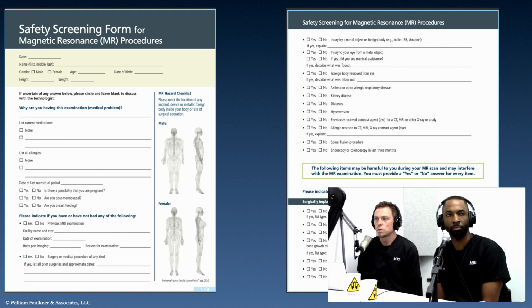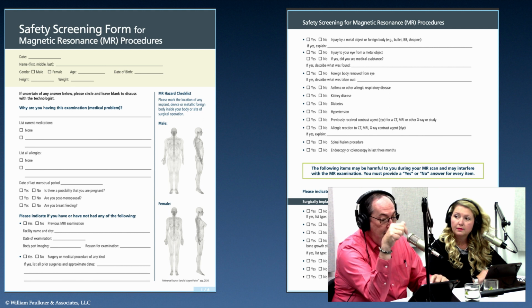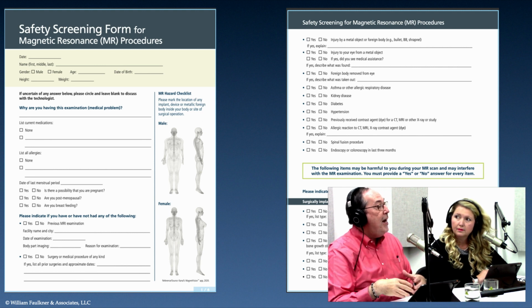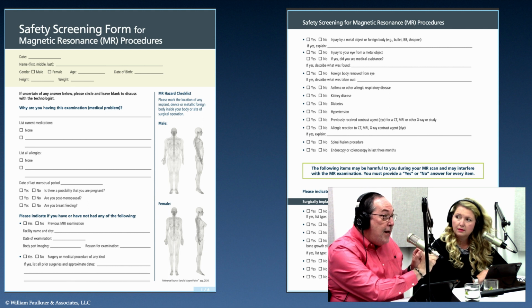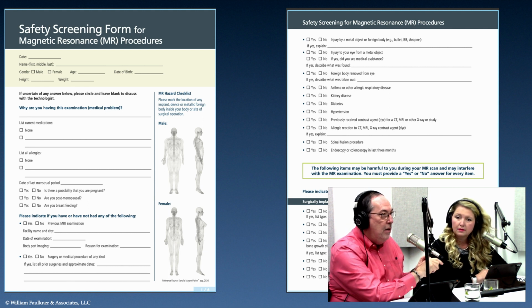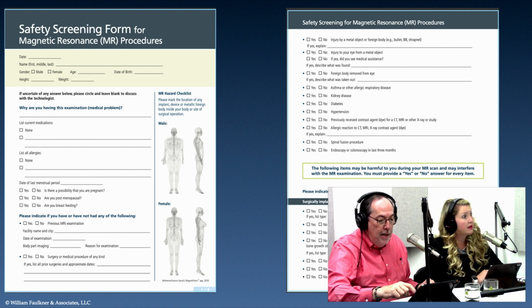So ACR has their own screening form, and it's outside of the document. In fact, in the document, they say it's available online, and you can easily find it on the website where the manual lives. If you look down through there it says screening form, and you can click on it. Where once it was 2 pages, it is now 6 pages.